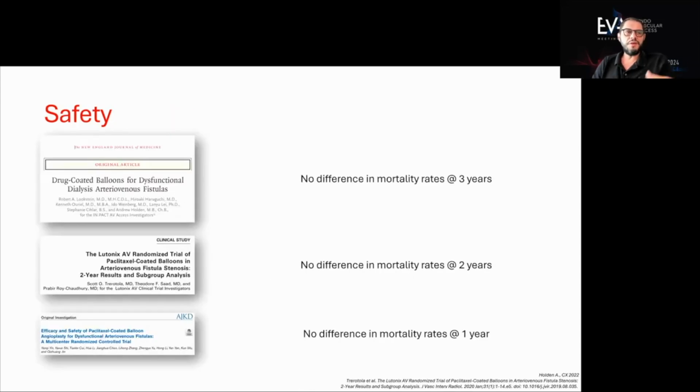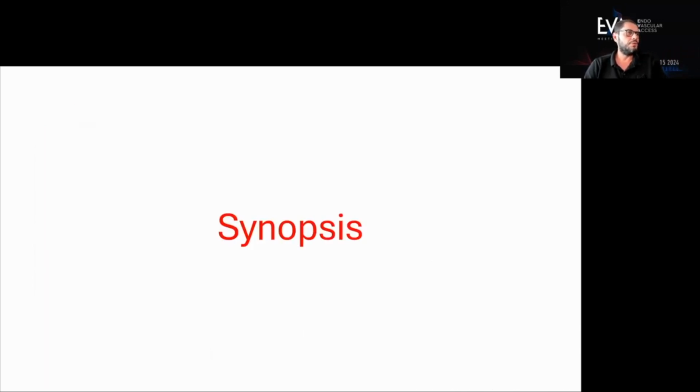What about safety? There are 3 studies with 1, 2, and 3 year outcomes that show no mortality signal in all of these studies, although they were also with different drug-coated balloons.